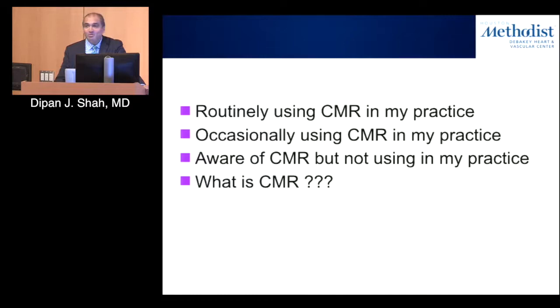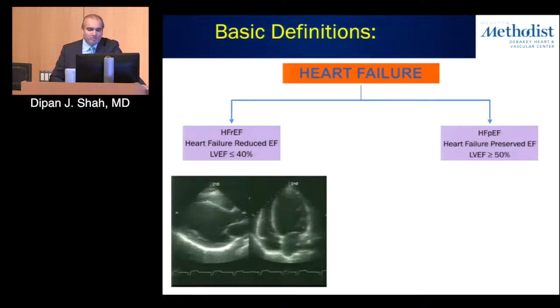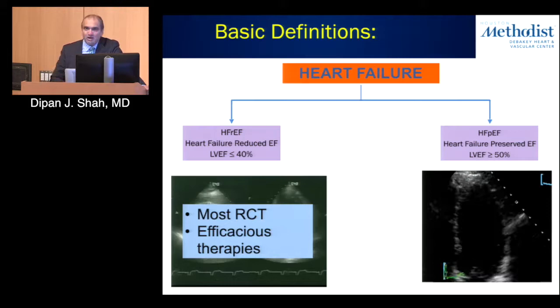So my goal in these next 15 minutes is to try to talk to you about how CMR can help you in managing your patients with heart failure. Now, you've probably already heard this today: when it comes to heart failure, the first thing you want to know is what's the LV function? What's the LV ejection fraction? The reason is that it helps you identify whether the patient has heart failure with reduced EF or heart failure with preserved EF. And echocardiography is going to be the mainstay technique for your initial assessment of LV function.